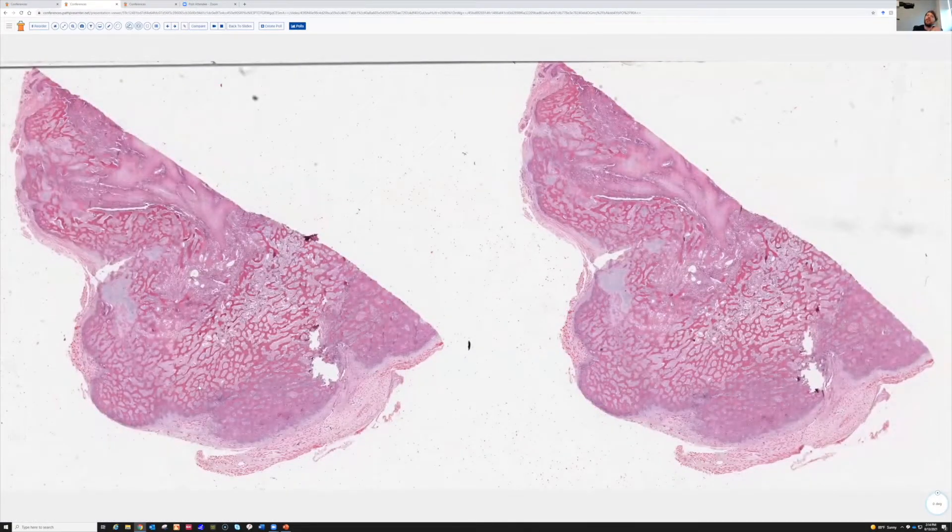Today, this is an upper arm mass deep in the muscle in a 25-year-old woman. It grew quickly over a period of a month or two and was quite painful, tender, and swollen. This is an incisional biopsy - a pretty large piece taken out of the lesion, but the entire lesion was not removed. Let's look at what we're dealing with here.